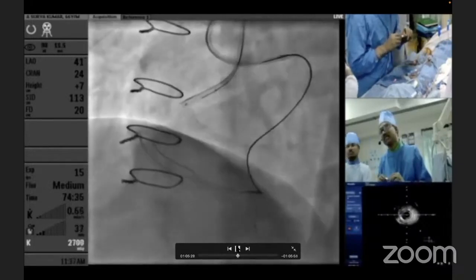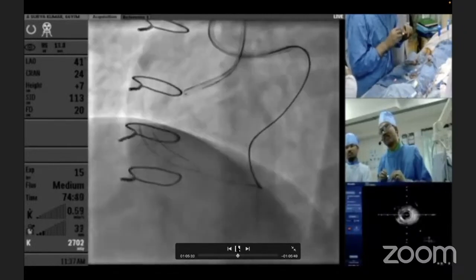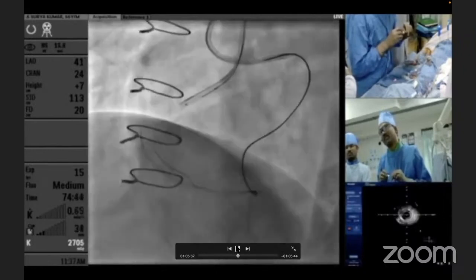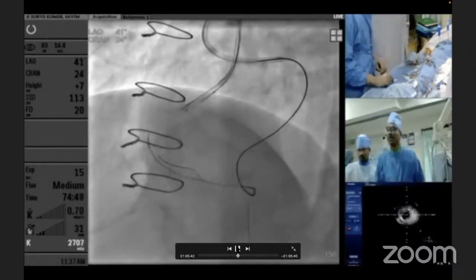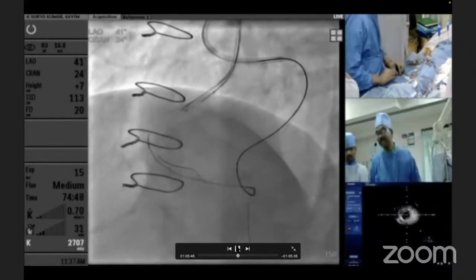And now you can see what we were talking about, buckling of vessel. Yeah, exactly. You can see that buckling exactly there at 5 o'clock. And the second important thing is you don't have to use contrast at all, right? Okay. Back.